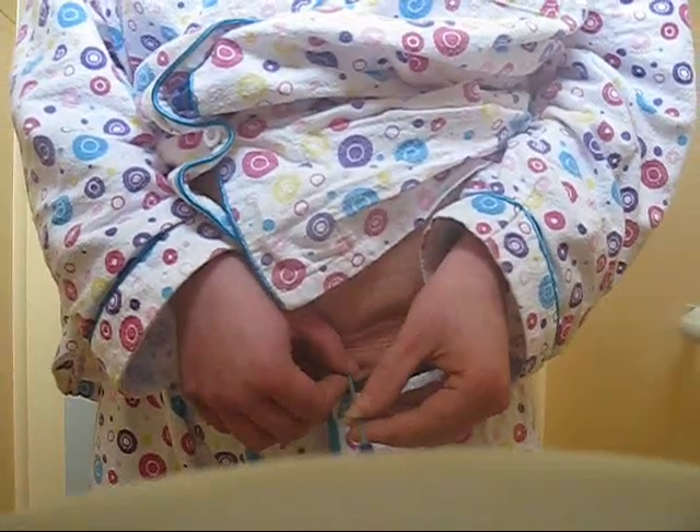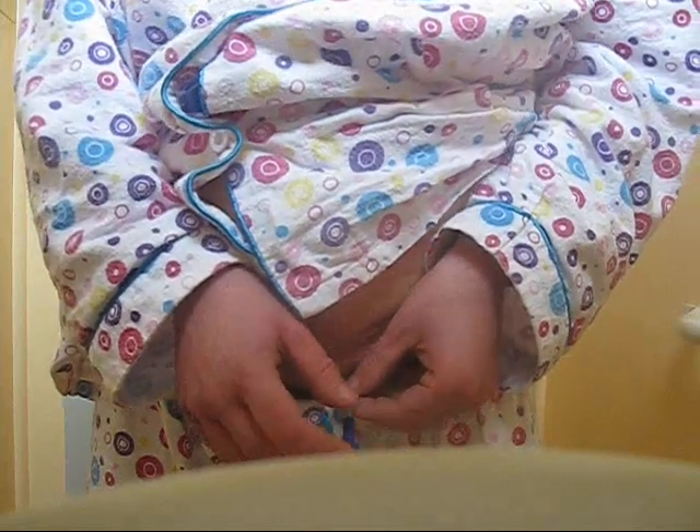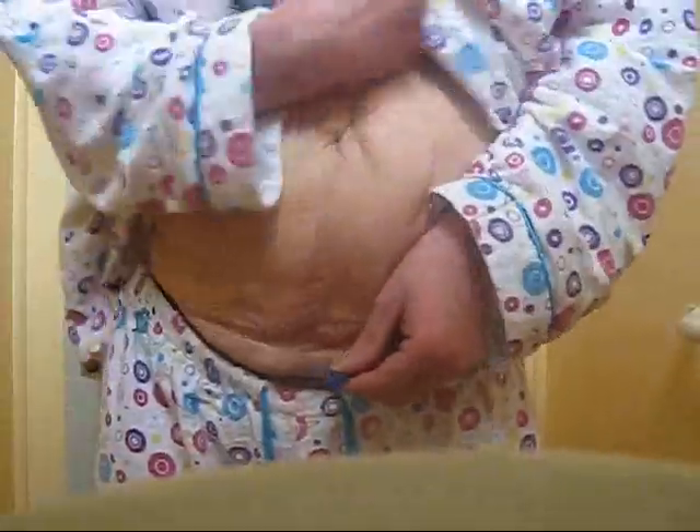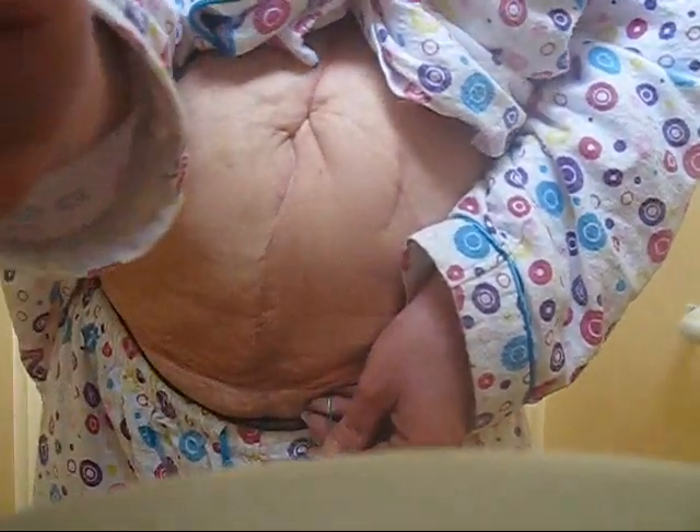Try and get it in as far as it will go. Then start to pull it out and start peeing. And that's my Mitrofanoff. It usually drains very well with complete bladder emptiness. I don't think you want to hear me pee, so I'm going to turn off the camera.